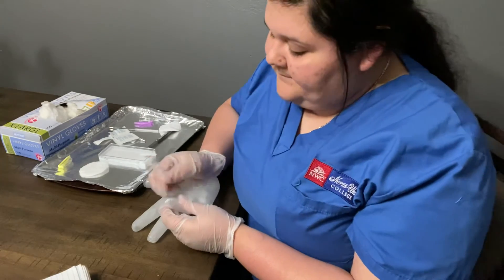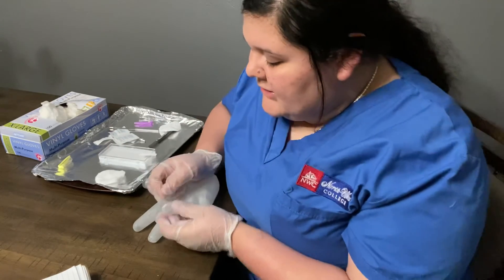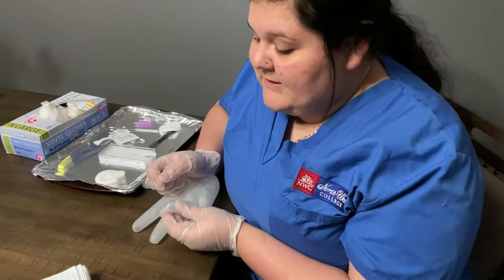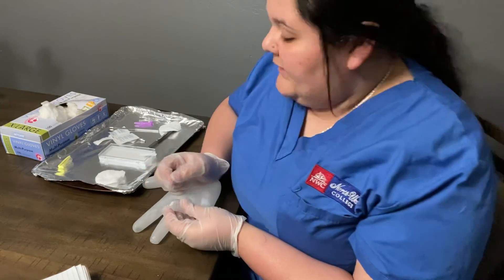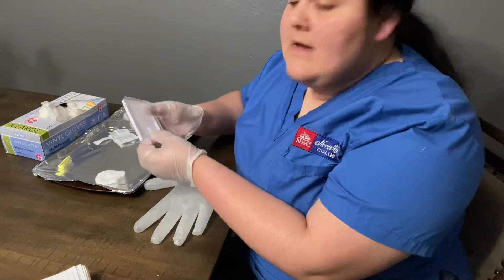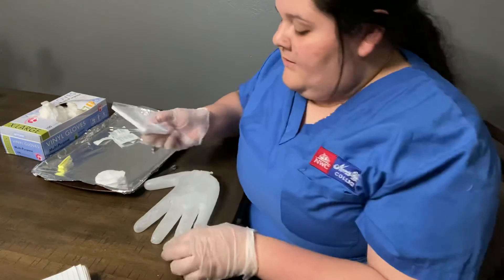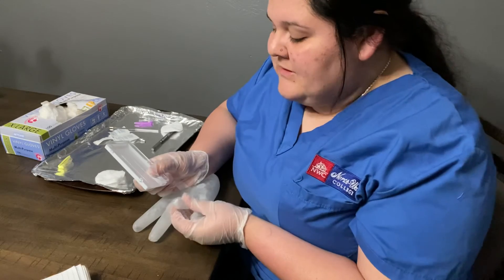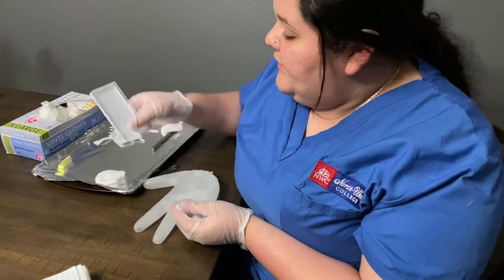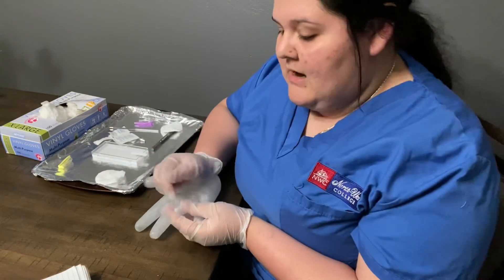Once you have that in the machine, you're now going to want to test for the glucose. You're going to want to wipe it again and make sure you're squeezing the finger to get as much blood as possible so you don't have to continue poking the patient. Once you have a good amount of blood, you're going to want to insert the glucose strip inside the meter, which will activate it. Once it's on, collect a little dab of blood, let it sit for a couple seconds, and it should give you the reading.